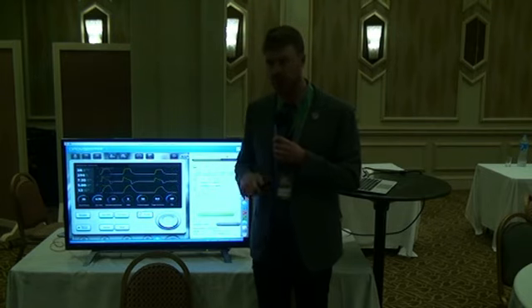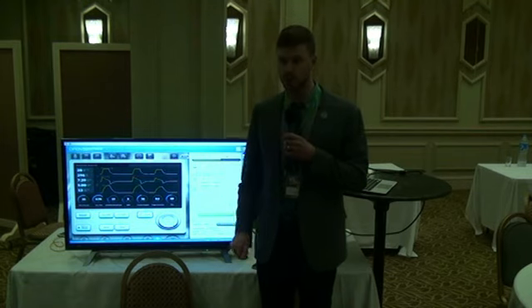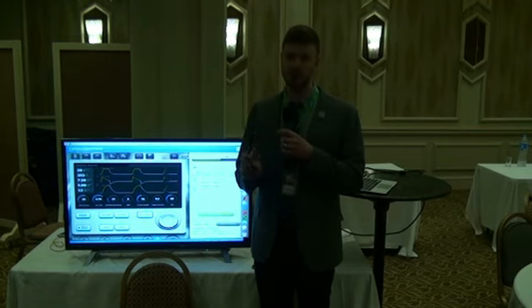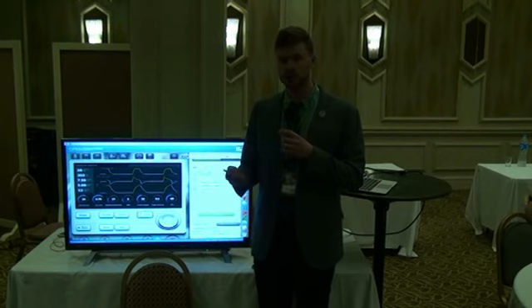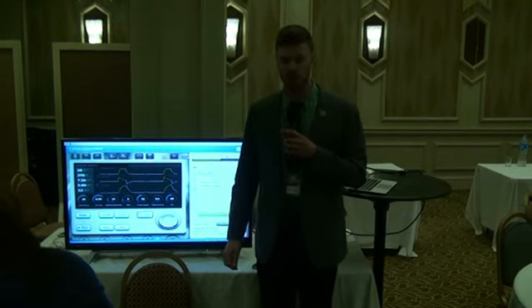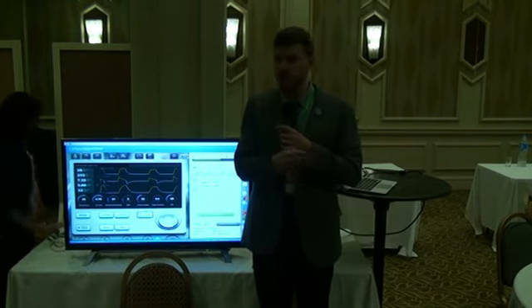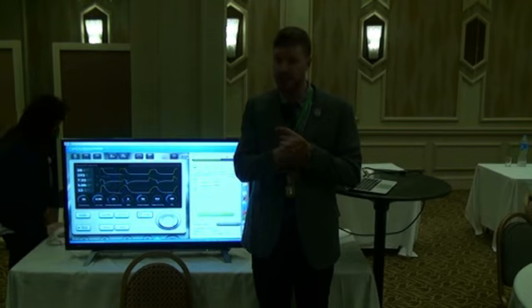And also high frequency ventilation, because you can't do end-tidal CO2 monitoring. And those would be the two principal applications, I think. And non-invasive ventilation. So those are probably the three. We don't measure end-tidal CO2 during non-invasive, just too leaky. Doesn't really make sense to do it. So we'll use it in those contexts. So premature or just dead space dependent. So if we can't monitor it, but we want some CO2.